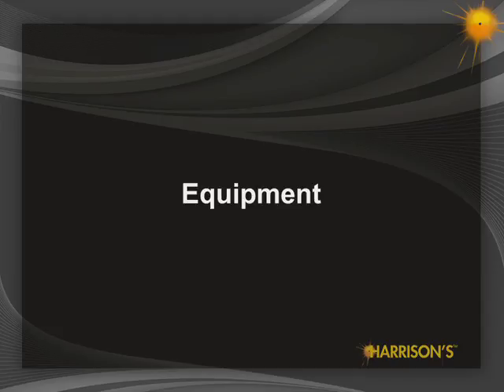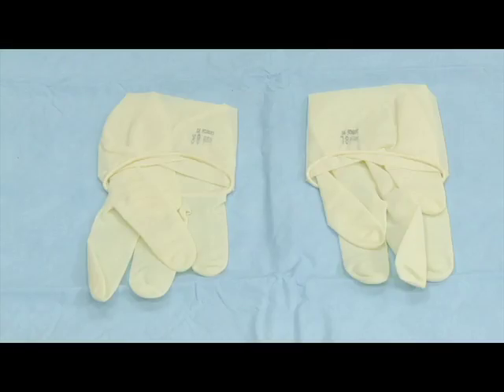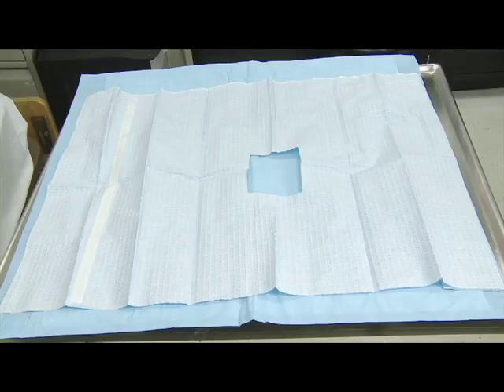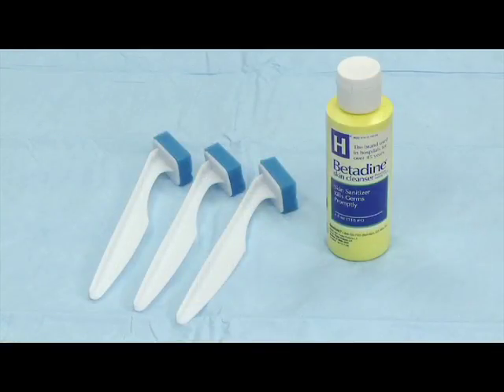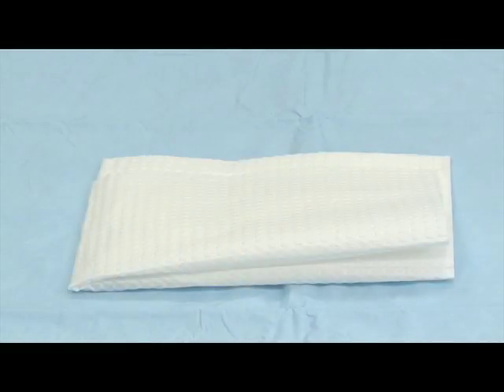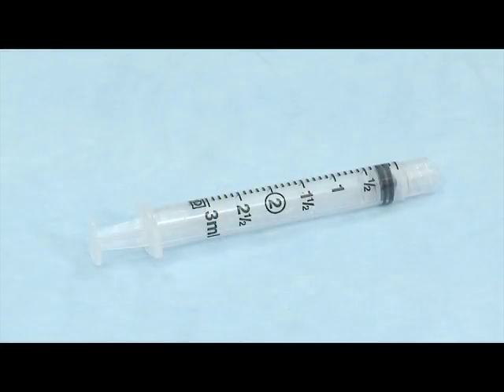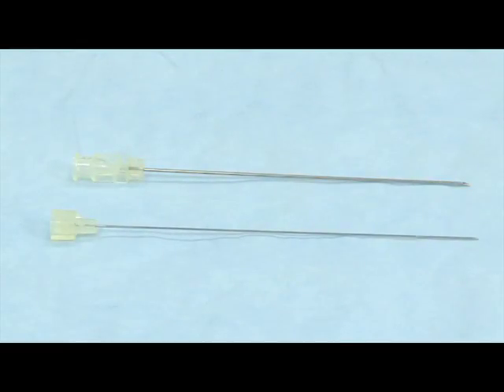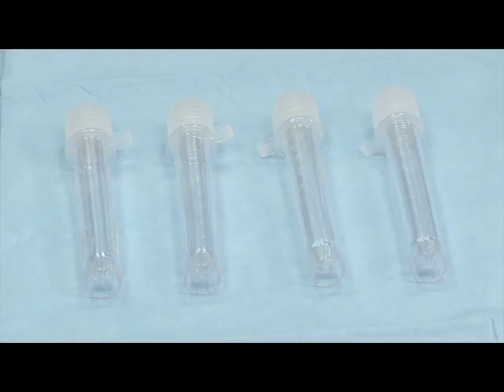A lumbar puncture kit typically contains sterile gloves, manometer, 3-way stopcock, sterile dressing, antiseptic with either an iodine or a chlorhexidine-based solution and skin swabs, sterile drapes, 1% lidocaine, 3 cc syringe, 20 and 25 gauge needle for lidocaine injection, 22 gauge spinal needle with stylet, noting that length will vary for infants, children, and adult patients, and 4 plastic collection tubes, numbered 1 to 4, with caps.